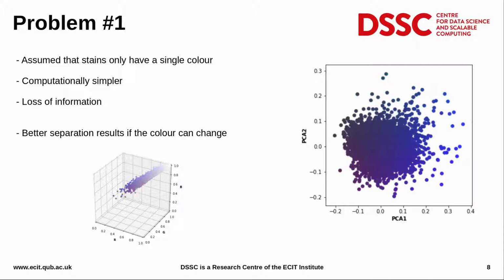Most existing methods make the assumption that the color of a stain is static across spatial locations in an image, regardless of the kind of tissue present at each location. This assumption dramatically reduces the computational complexity of the problem, and good results can be achieved when using it. However, in this work, we show that better results can be achieved when not using this assumption.